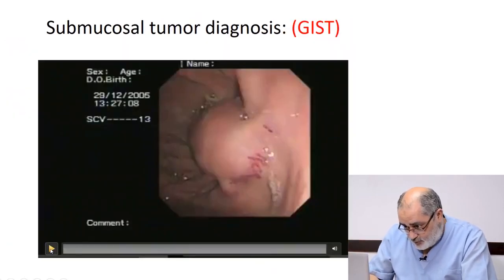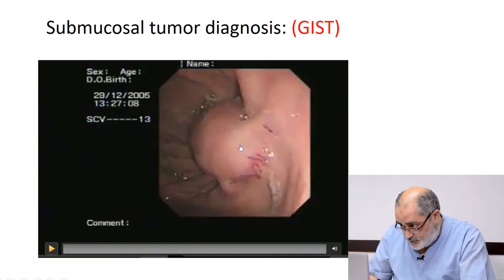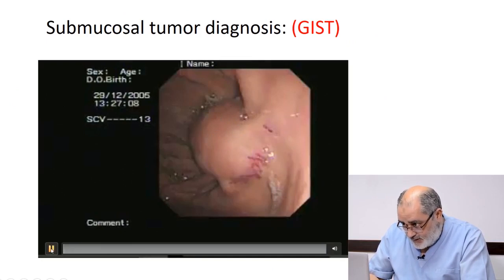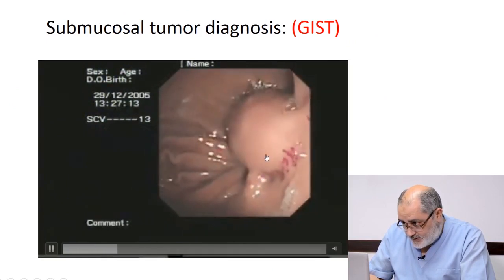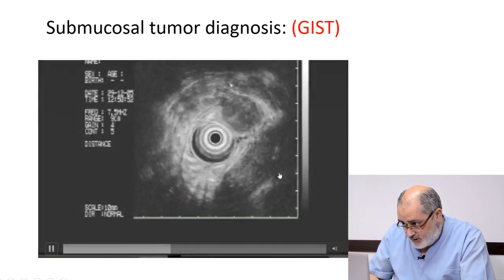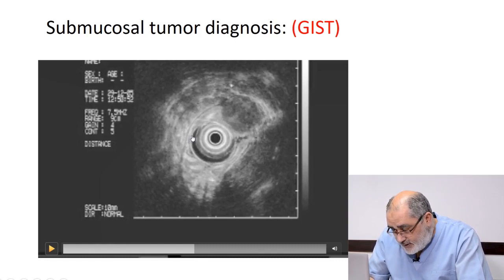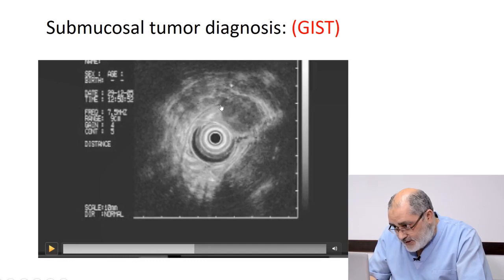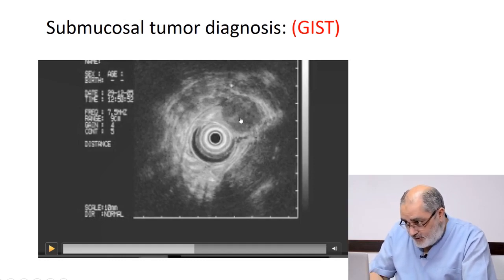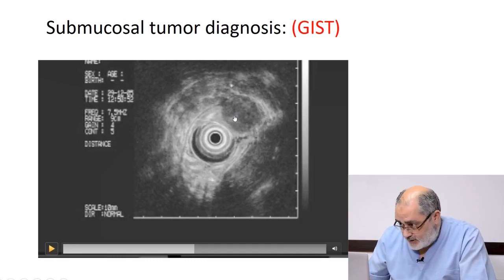Here is a common submucosal tumor — a GIST. It is a bulge in the stomach covered by totally normal mucosa, located in the gastric body in the lesser curvature. Very nicely seen: a mass originating from the fourth muscularis propria layer. Counting the layers: innermost is the hyperechoic mucosa, then hypoechoic muscularis mucosa, then hyperechoic submucosa, then hypoechoic muscularis propria. Following this layer, we can clearly see this mass originating from the muscularis propria — the fourth layer. So the most probable diagnosis is gastrointestinal stromal tumor (GIST).